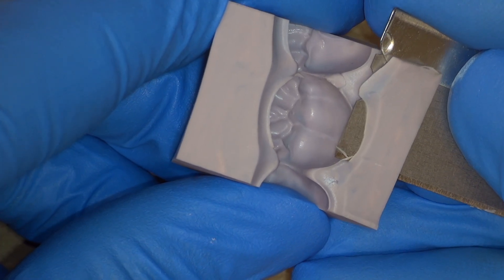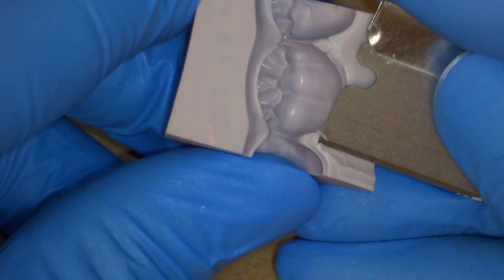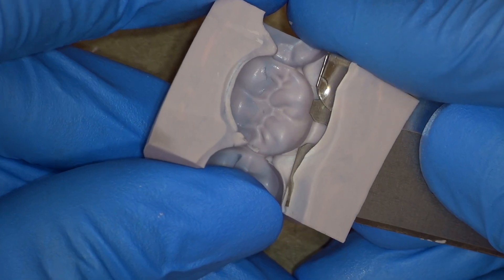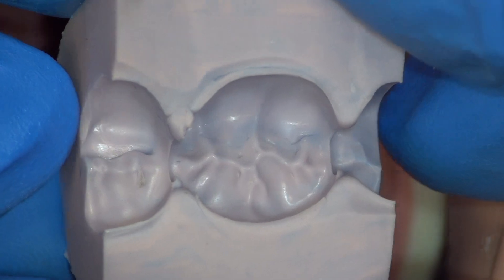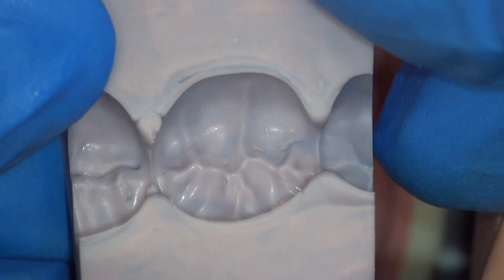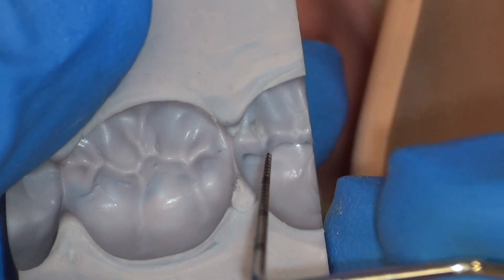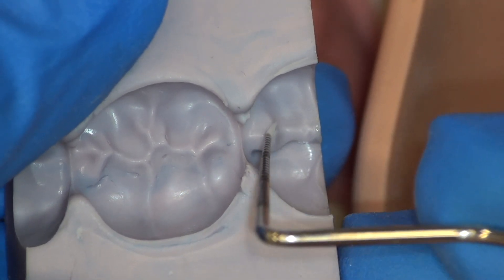Take the additional time necessary to trim your putty to the gingival margin. This will lead to a nice temporary immediately upon fabrication and a minimal amount of excess flowing over the gingiva and the adjacent teeth. Carefully evaluate the internal surface of your putty to make sure there are no pieces of debris that would interfere with seating. Here we see a small piece and remove it.